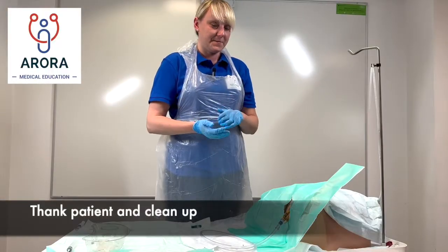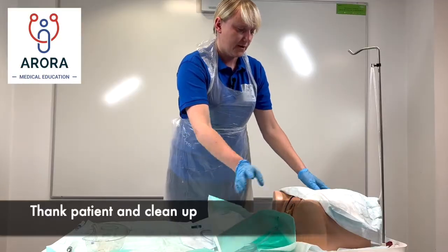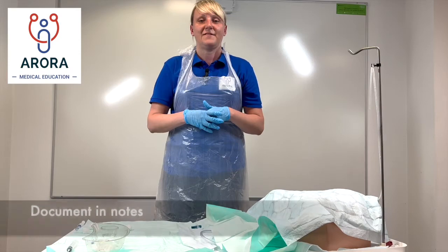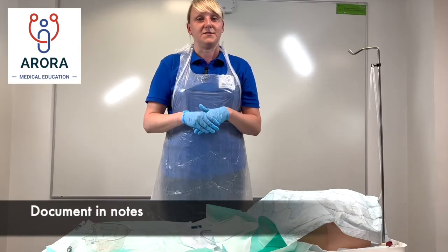Next we'll thank the patient and clean everything up — remove all the drapes and cover them up to protect their dignity. Finally, to complete the procedure, we want to document in the notes that we've inserted a female catheter.